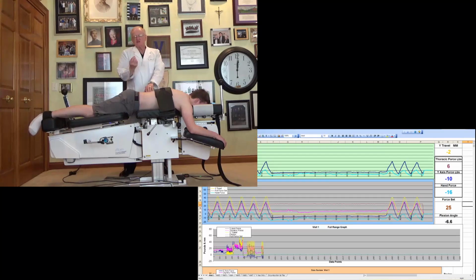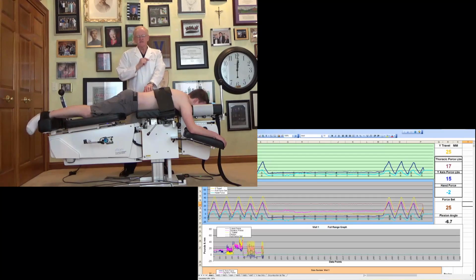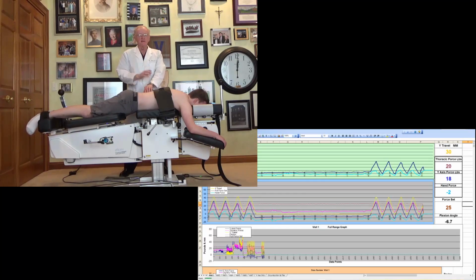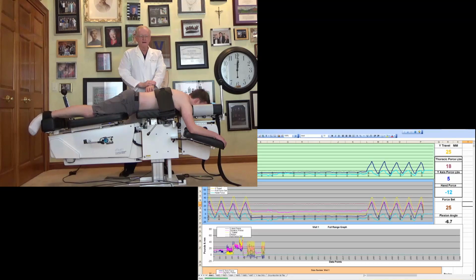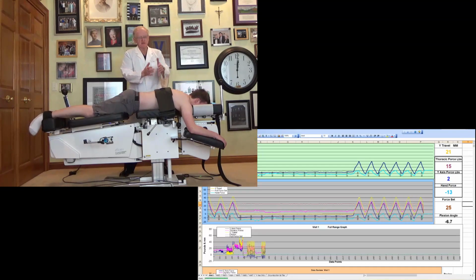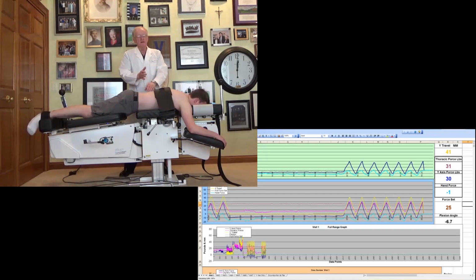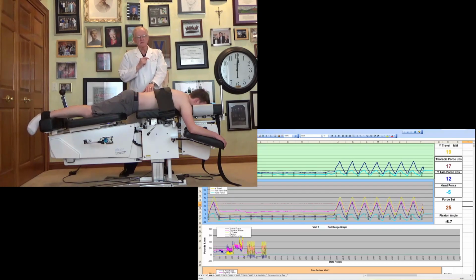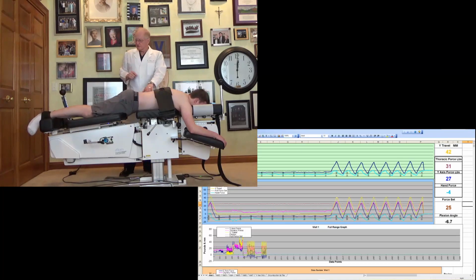As a patient shows good tolerance to this technique, I'm going to increase the hysteresis and creep within the intervertebral disc. That is, if I hold the spine under distraction, I enhance the imbibition of fluids from the cancellous vertebral bone through the end plate into the disc and stimulate mechanoreceptors. So it would look like this.